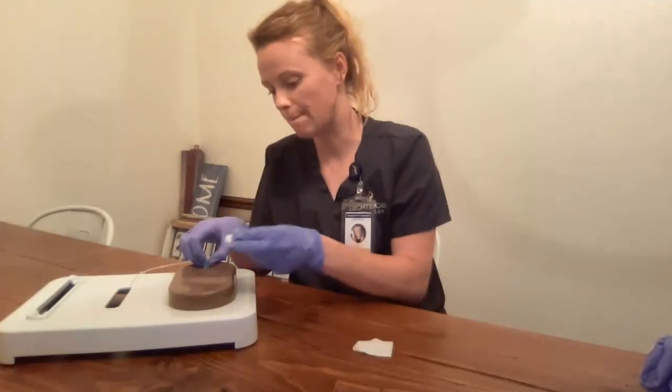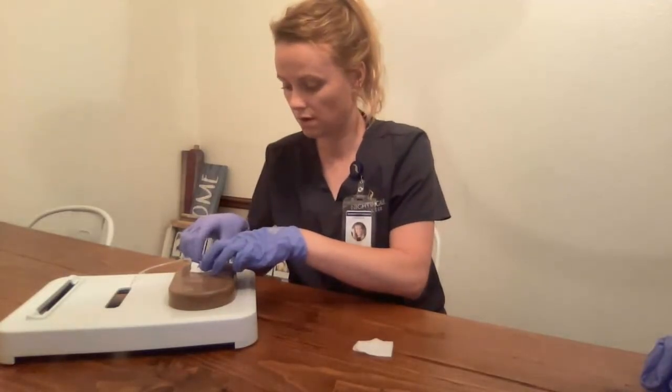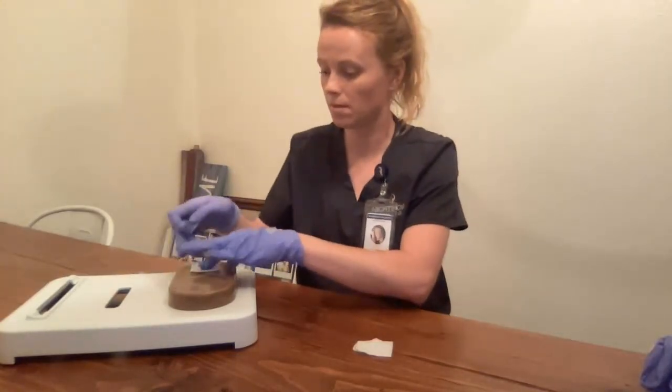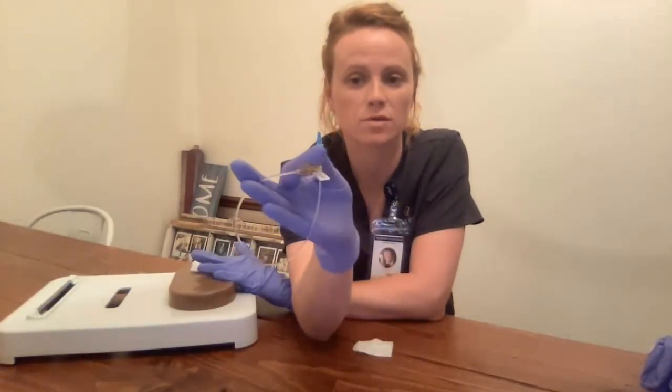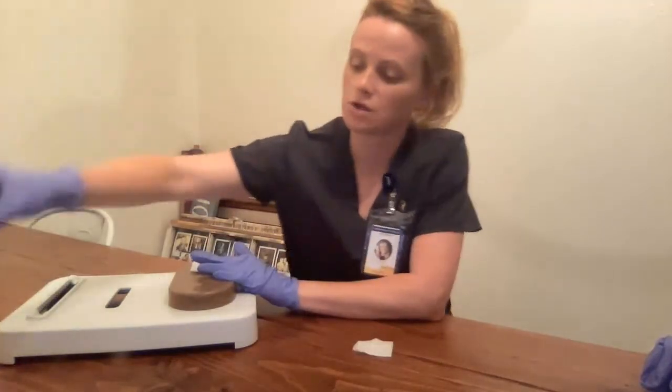I'm going to get my gauze here and put it above the associated site while removing the catheter. I want to inspect the end of the catheter here — I need to make sure it's intact. It is. I want to also check for length: 1 inch. I'm going to dispose of this in my sharps container.